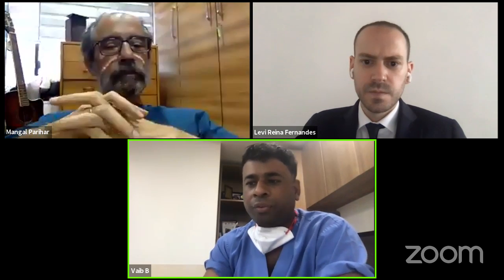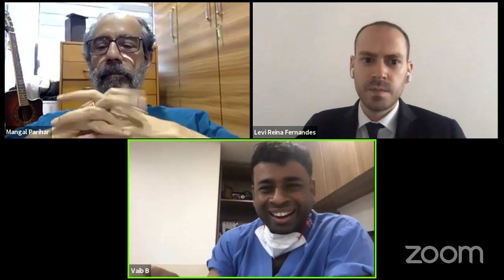Yes. No, so very impressive software. Impressed by the entire planning and the concept of JLCAs. Now, as Dr. Mangal said, I'm primarily an arthroplasty surgeon. So my questions would be relatively simple.